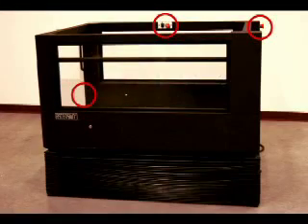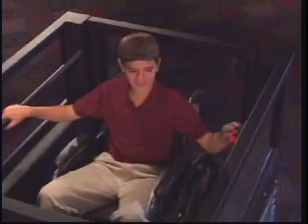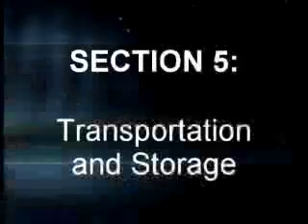Locate the 3 operating switches on the lift. One is beside the lower landing gate, one is inside the lift car, and one is beside the upper landing gate. Holding any operating switch up will raise the lift car. Holding any operating switch down will lower the lift car. For instructions on using the lift outdoors, refer to the operating manual.